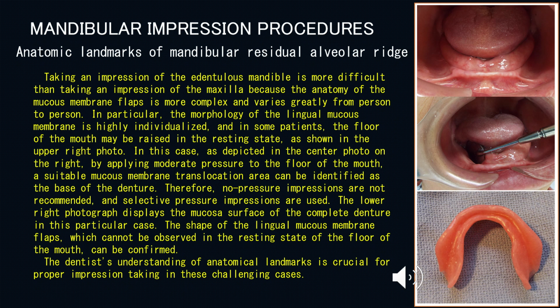The shape of the lingual mucous membrane flaps, which cannot be observed in the resting state of the floor of the mouth, can be confirmed. The dentist's understanding of anatomical landmarks is crucial for proper impression taking in these challenging cases.